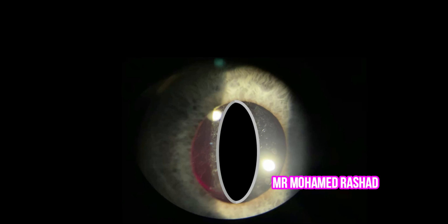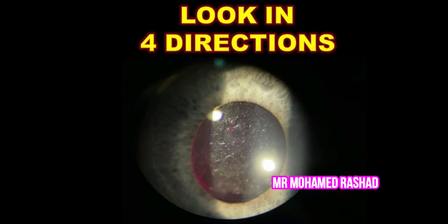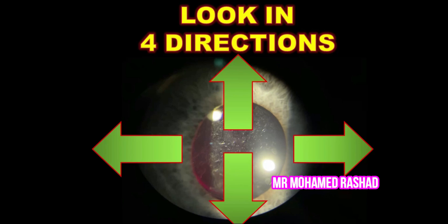We create a central opening and can enlarge it on both sides from the center to the periphery to achieve a diamond-shaped opening. Because of the small pupil, we have to make sure this opening is large enough. We can instruct the patient to look in four directions — up, right, down, and left — to make more enlargements if needed.